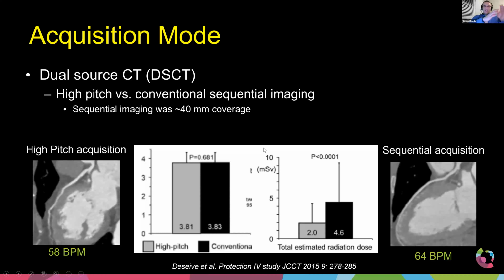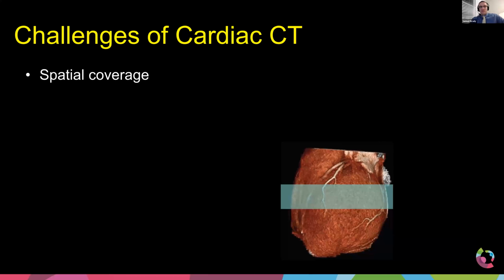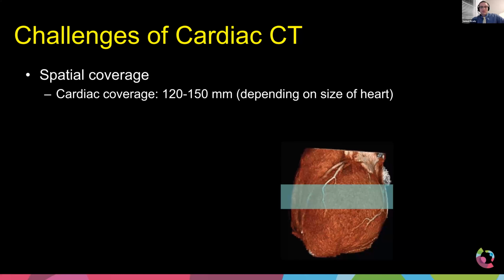So as you can kind of see, as we're moving forward, 2008, 2009, doses were higher. Now 2015, the doses are coming much lower. I think you're going to see that progression as we keep stepping through. As we get farther and farther along in time, the technology is helping us get the doses much, much lower in the cardiac imaging. So once again, the goal here is to get the whole heart.